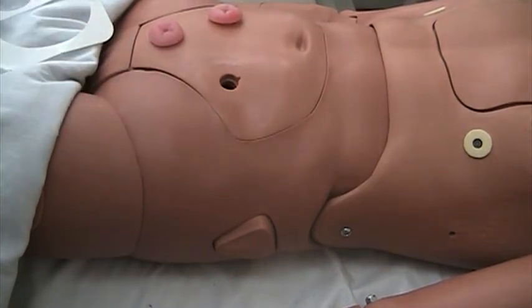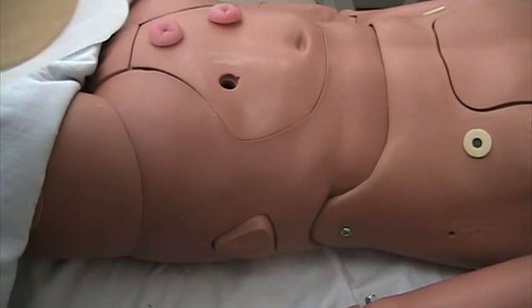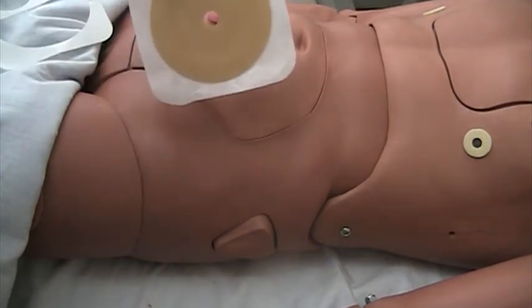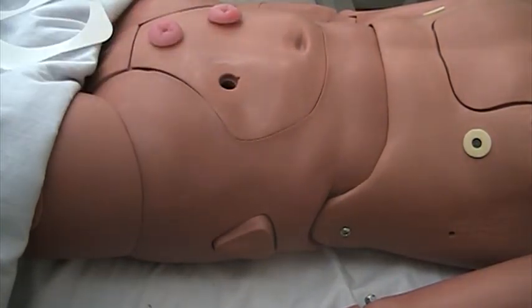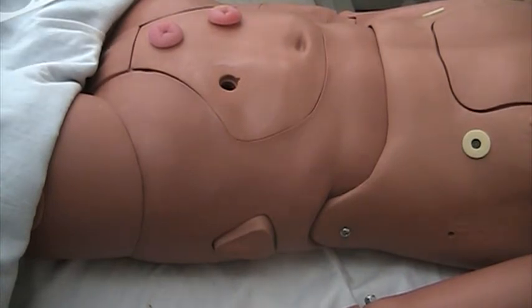Okay, taking it off, you would then clean. This wafer would dry out over a couple of days. You just use the manufacturer's recommendations on how often to change it, and also the patient's preference. Patients that have had ostomies for a long period of time, they're going to tell you exactly how to take care of it. The best thing that you could get in the hospital is a patient that has an ostomy that doesn't mind teaching you, because they love to sit and talk about it, to teach people how it works.